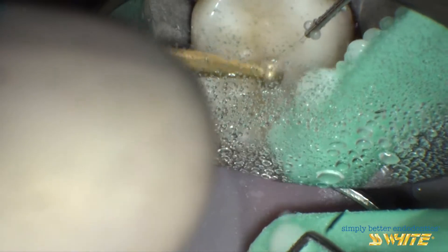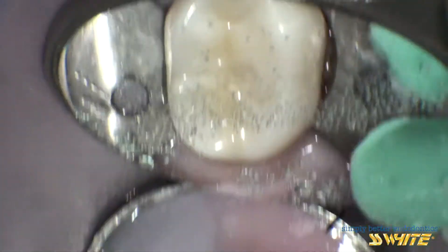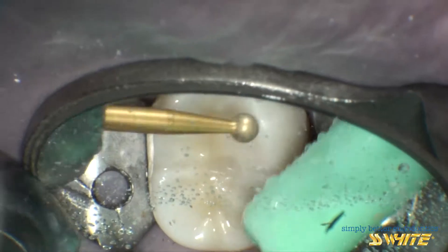We will start with the 801. This series is specifically designed to cut zirconium, and it will dramatically reduce the time necessary to drill through this hard material.